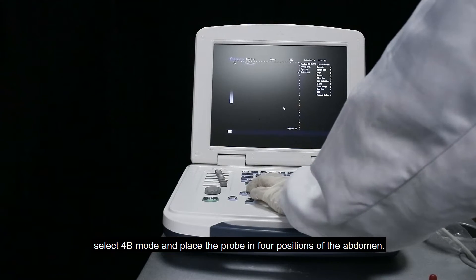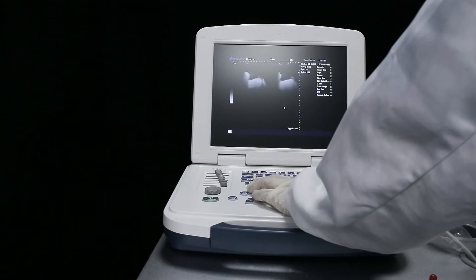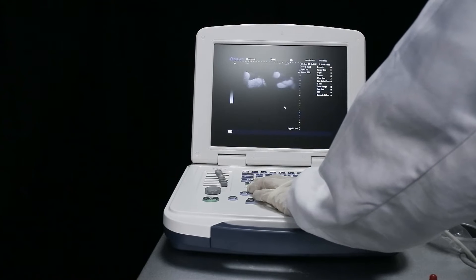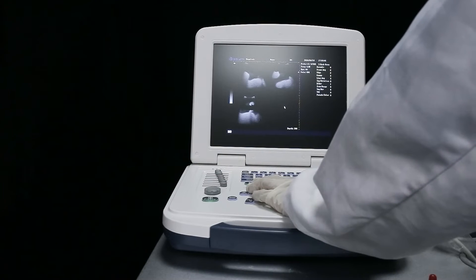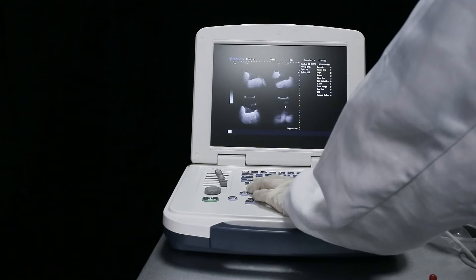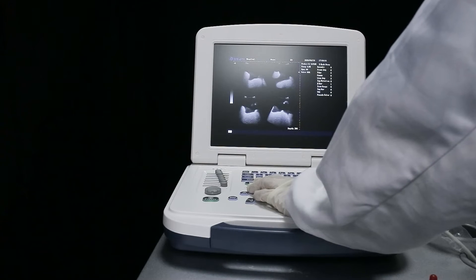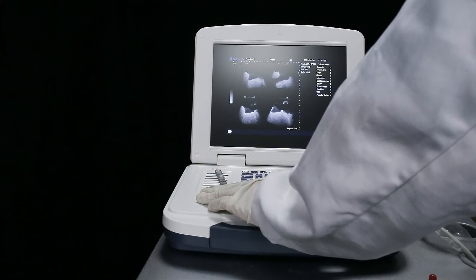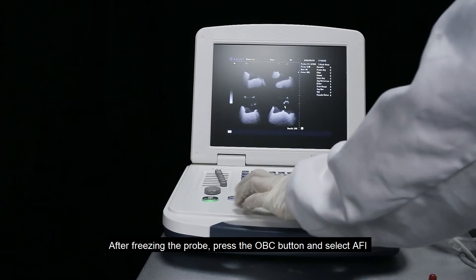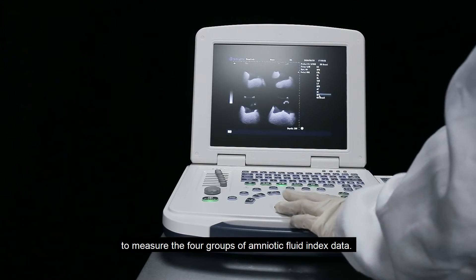Place the probe in four positions of the abdomen. After freezing the image, press the OBC button and select AFI to measure the four groups of amniotic fluid index data.